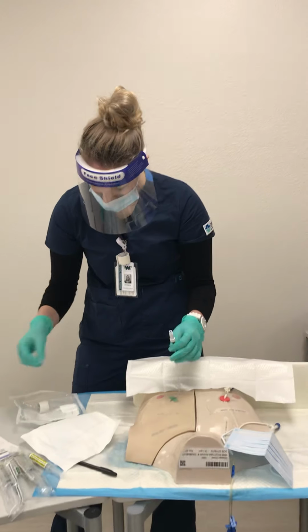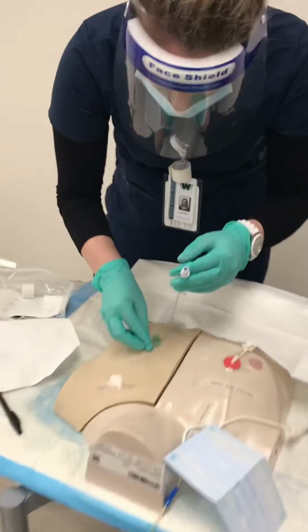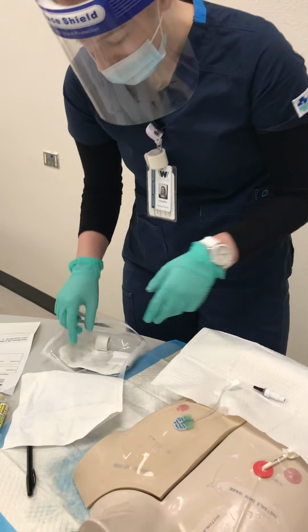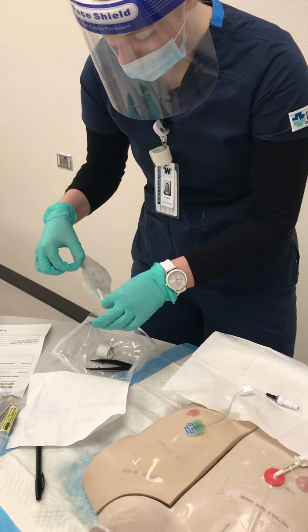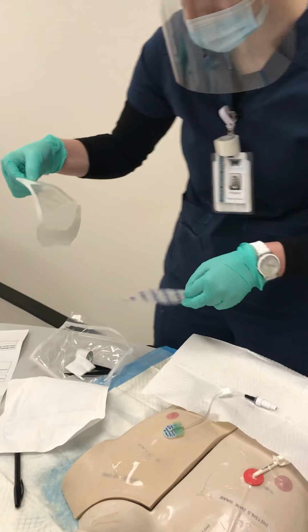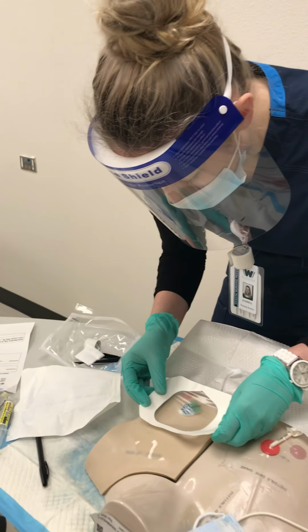And I'm going to grab my padding here and then insert it right there. Okay, and now I can put on the dressing. So careful just to touch the outer corners with this unsterile hand that I have here, and place it over the port.